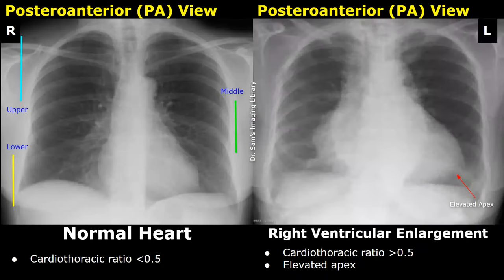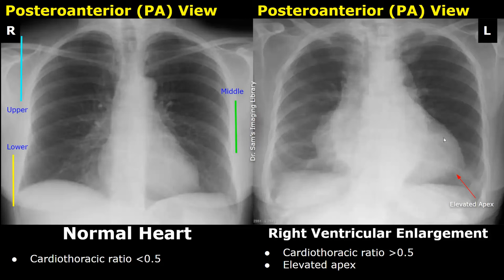Now we have a case of right ventricular enlargement. In normal cases the cardiothoracic ratio is less than 0.5. In cases of significant right ventricular enlargement the cardiothoracic ratio will be greater than 0.5. Another feature is that the apex will be elevated, whereas in the normal image the apex seems to be resting over the diaphragm. This elevation of the apex can be a sign of right ventricular enlargement.